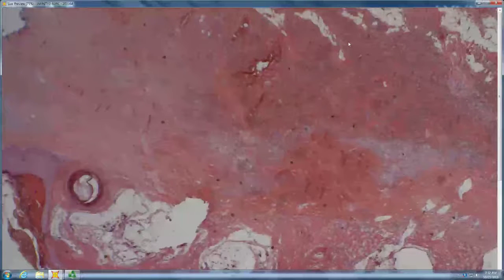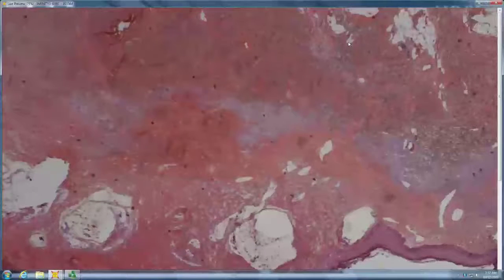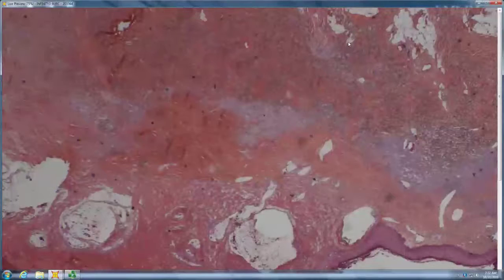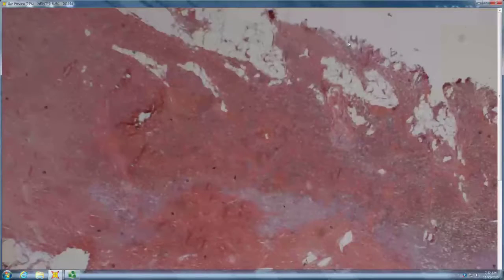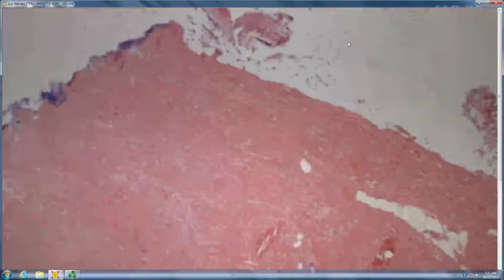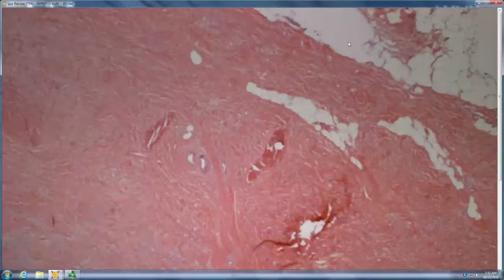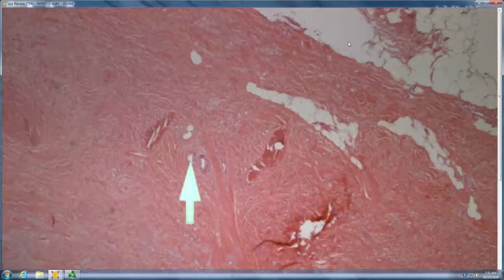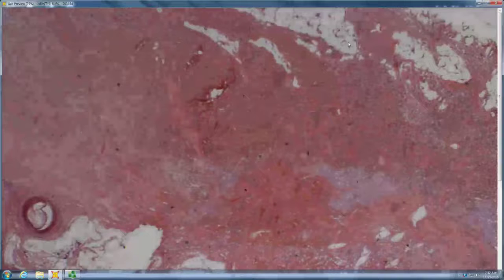The thing that catches my eye first is those ectatic vessels, some might say massively ectatic vessels, right? And elastosis beneath. Is it satisfied with staying where solar elastosis would be, or does it go considerably deeper? I think it goes deeper, and it's present within follicular structures. Speaking of which, tell me about the health of the associated follicle. It is being destroyed. It's gone. So maybe radiation dermatitis, and you see ulceration.